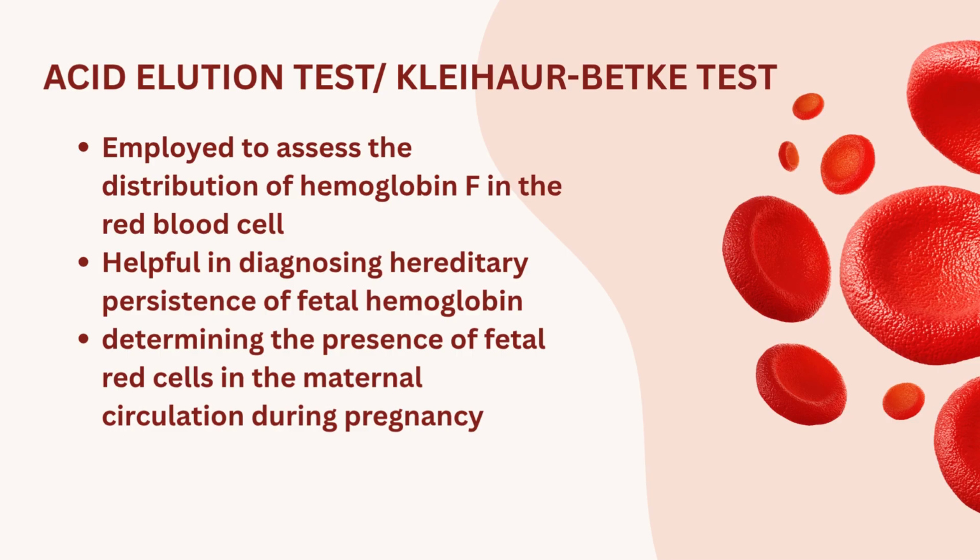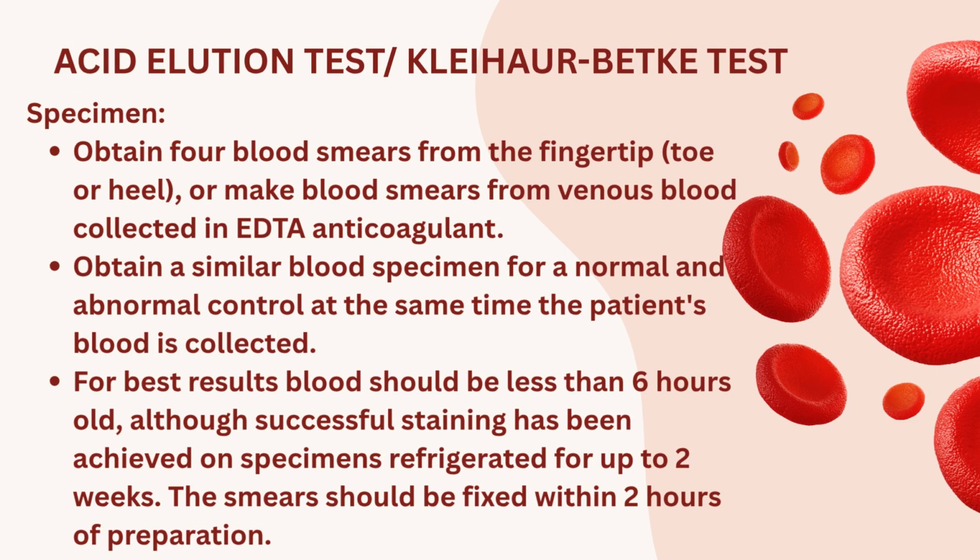It is used to estimate the volume of fetal-maternal hemorrhage, to determine if an increased dose of Rh immune globulin, or RhoGAM, is needed for an Rh negative mother who delivers an Rh positive baby.